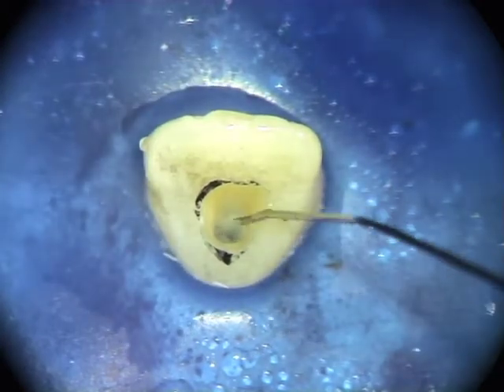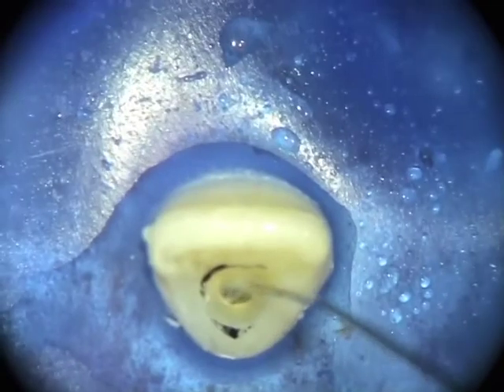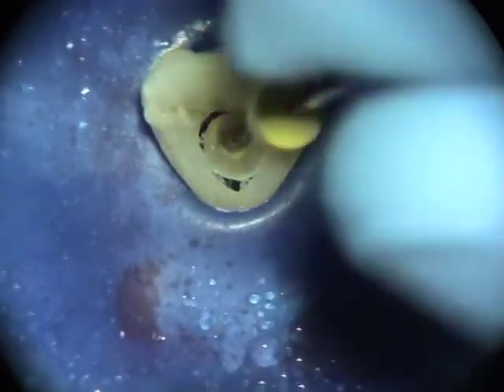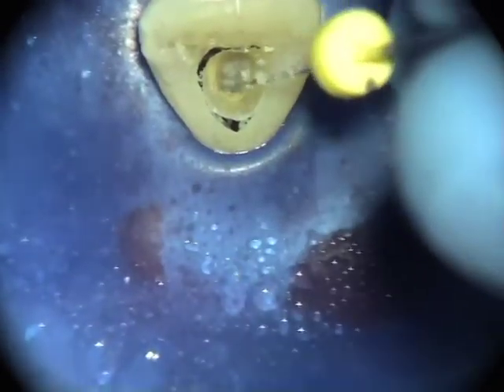Debris should be removed by irrigation with sodium hypochlorite solution. It is often helpful to use a number 10K file to loosen debris within the access cavity.